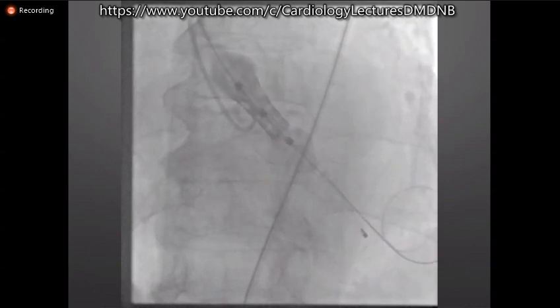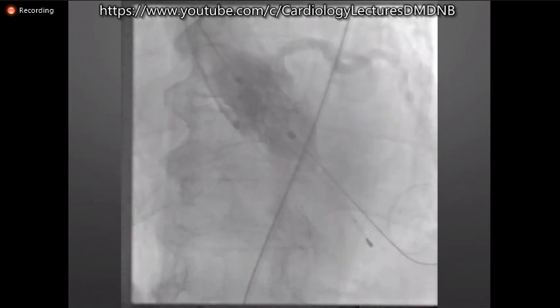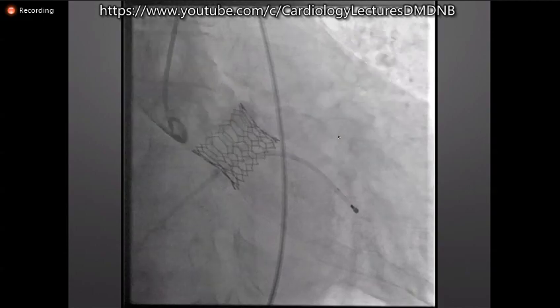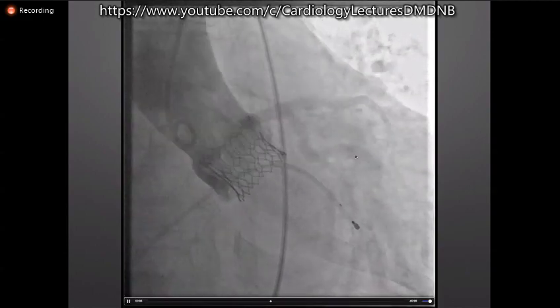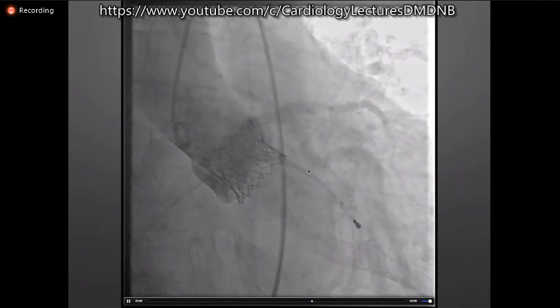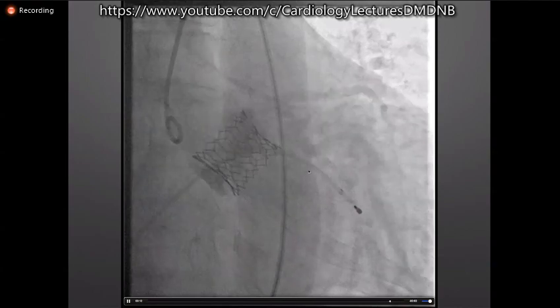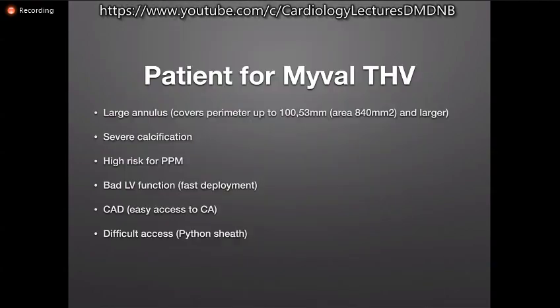We implanted the valve in a position with a partial inflation, angiogram, and then full inflation. Angiogram after the case revealed good position of the valve. You can still see the calcification around the valve, around the prosthesis, and we didn't get a significant residual gradient.